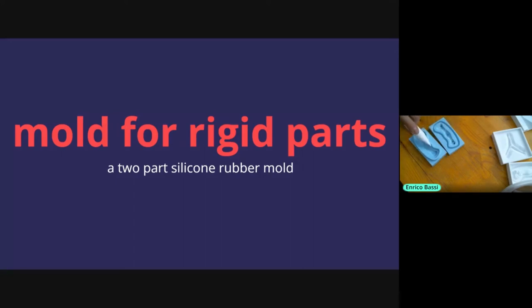This border is not straight, it has an angle. If I remember correctly, I used 10 degrees. And this helps to, you know, align the two pieces of the mold without sliding. You see that the match is perfect. You put it in this position, and with a syringe, you inject the material in one hole until it comes out from the other two. So this is a very small mold, and we'll see how to start from the file I shared with you. So basically, the 3D file of this.